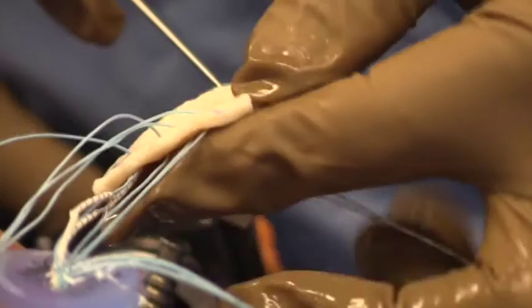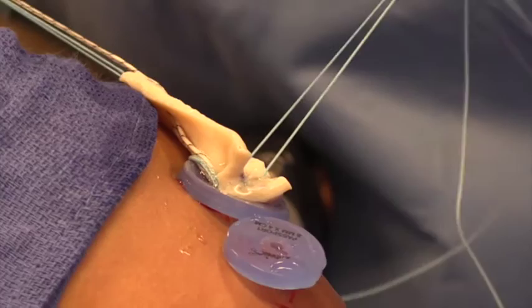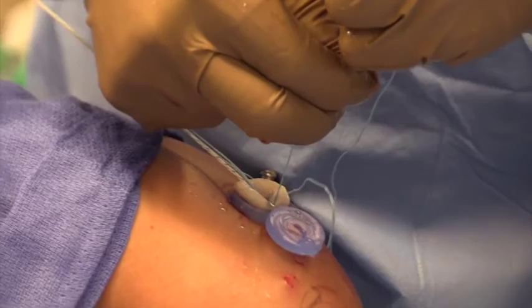Each of the sutures were passed through the 4 holes respectively. This was followed by the placement of two holes at the appropriate medial-to-lateral distance for grasping of the heavier suture limbs.